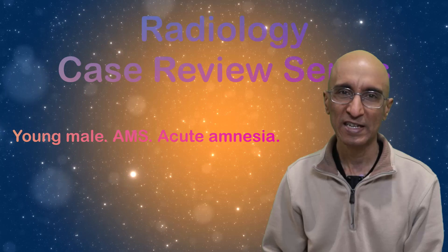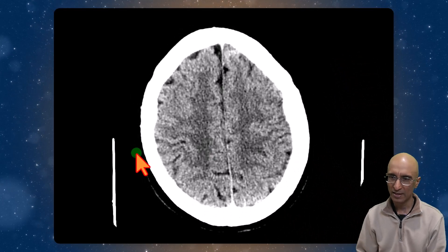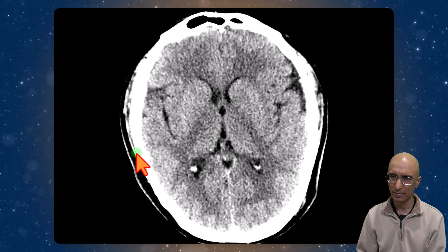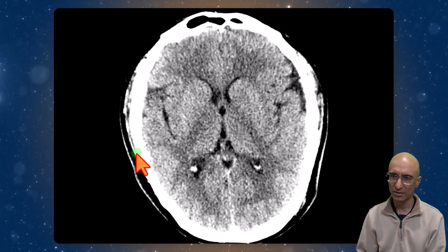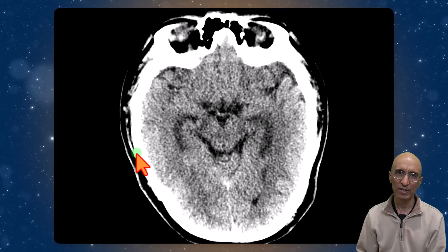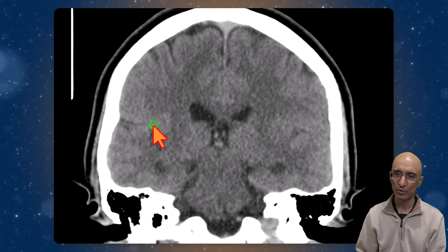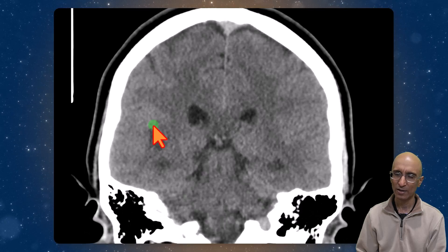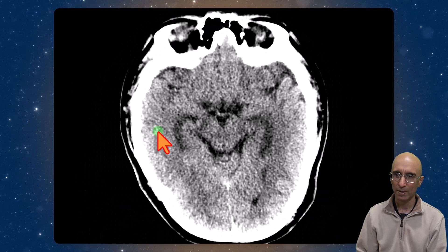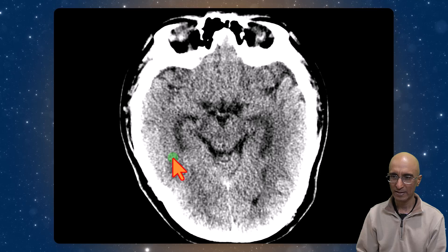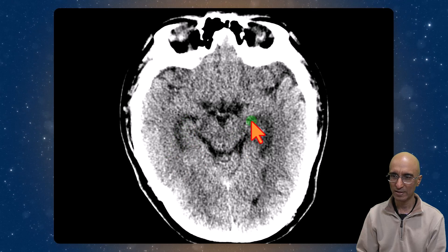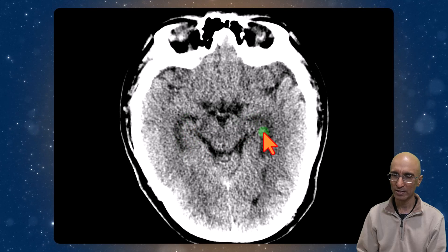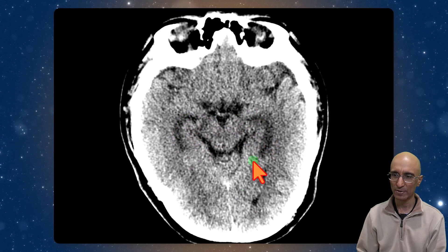The patient initially underwent a CT head examination. As I scroll through, we don't see any obvious acute hemorrhage, mass effect, or midline shift. The study was read out as negative. I'm going to show you coronal reconstructions as well. Again, we don't see any obvious acute abnormality, but upon closer evaluation we can see there is symmetric hypodensity in the temporal lobes with a comma-shaped configuration in the region of the hippocampus.